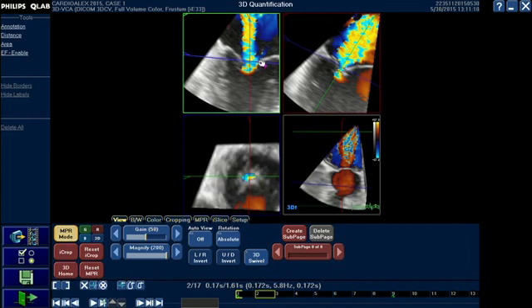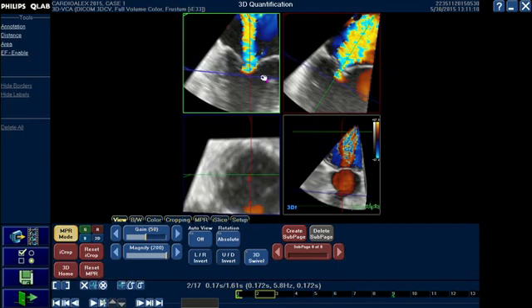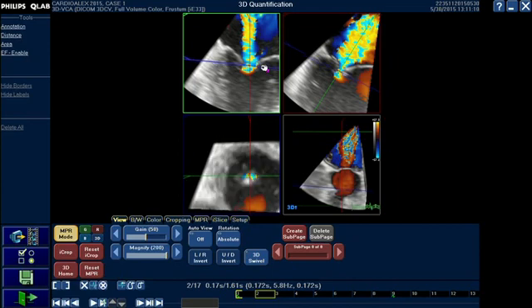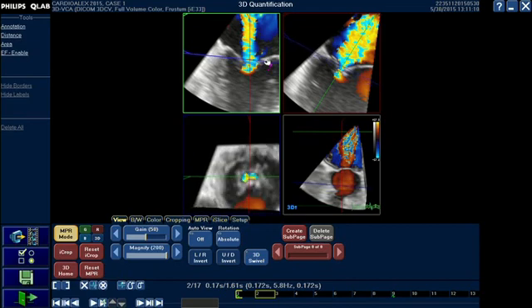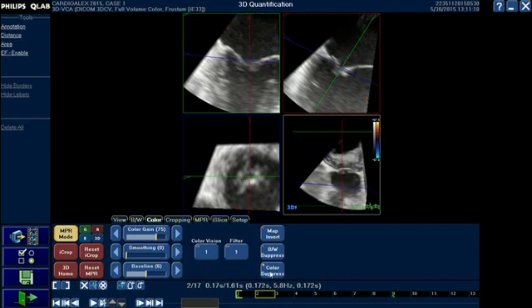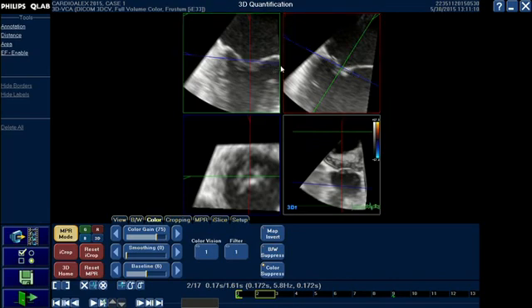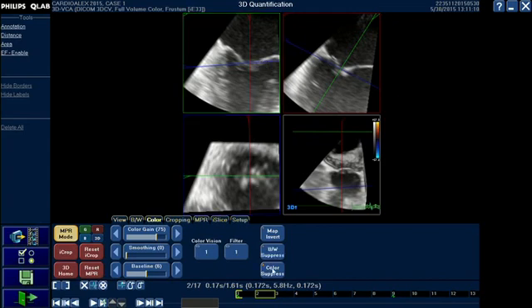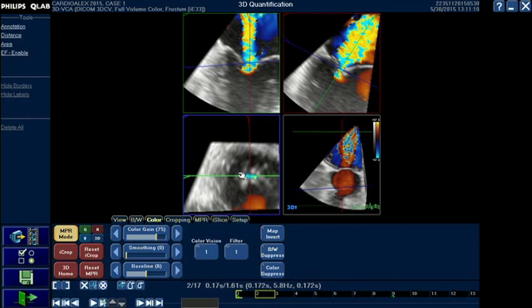Coming closer now — if I move downwards toward the LV I will lose everything; this is the PISA itself. Now I'm cutting at the neck of the jet, just proximal to the orifice. From here you can toggle the color on and off to see the orifice in grayscale, which reassures you that you are cutting at the true regurgitant orifice. If not, you can modify your lines and come closer to the orifice, then put the color back to get a proper vena contracta view.